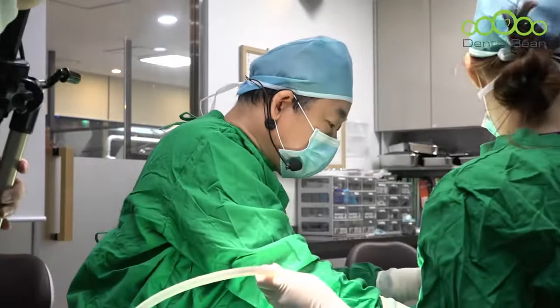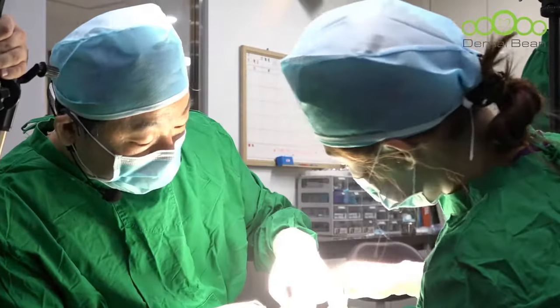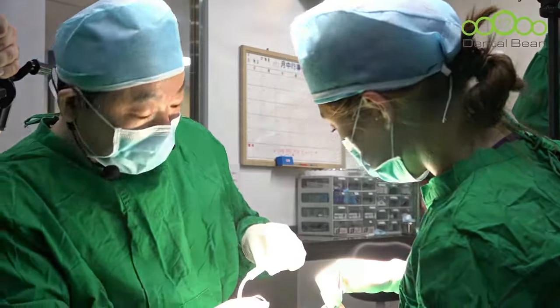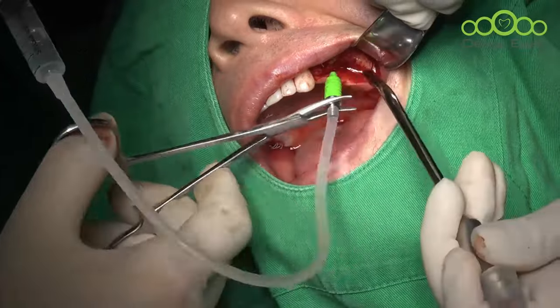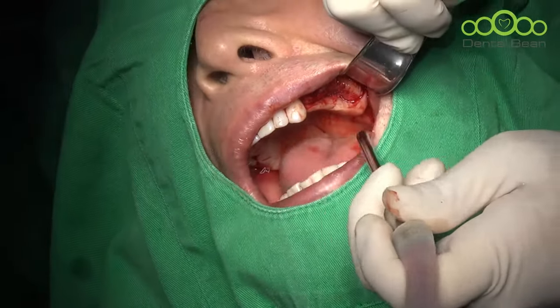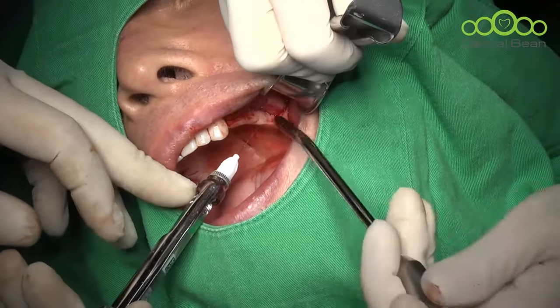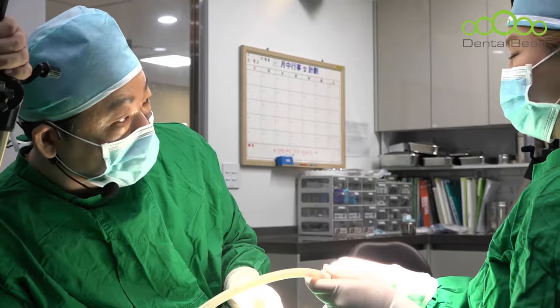I'll spend a large amount of saline to separate the membrane. Let's seal. Difficult to seal. Okay, and then inject saline point. Patient feels discomfort. Maybe I need anesthesia. But this is good news. Patient feels discomfort because the membrane is separating.